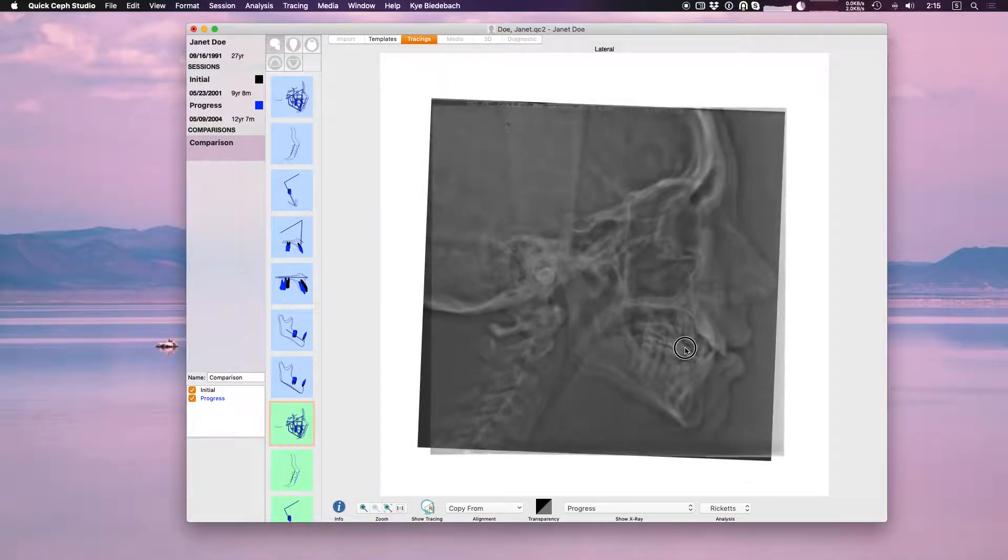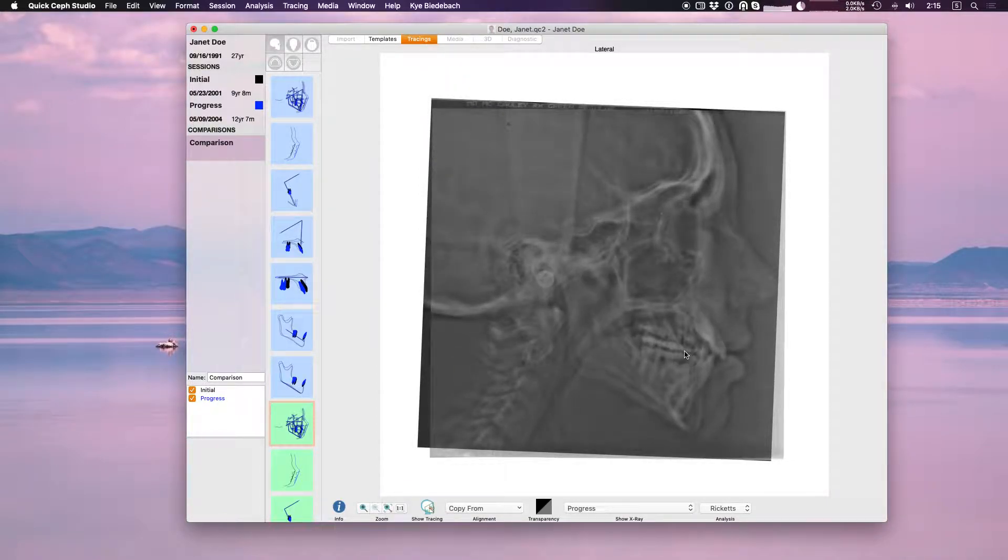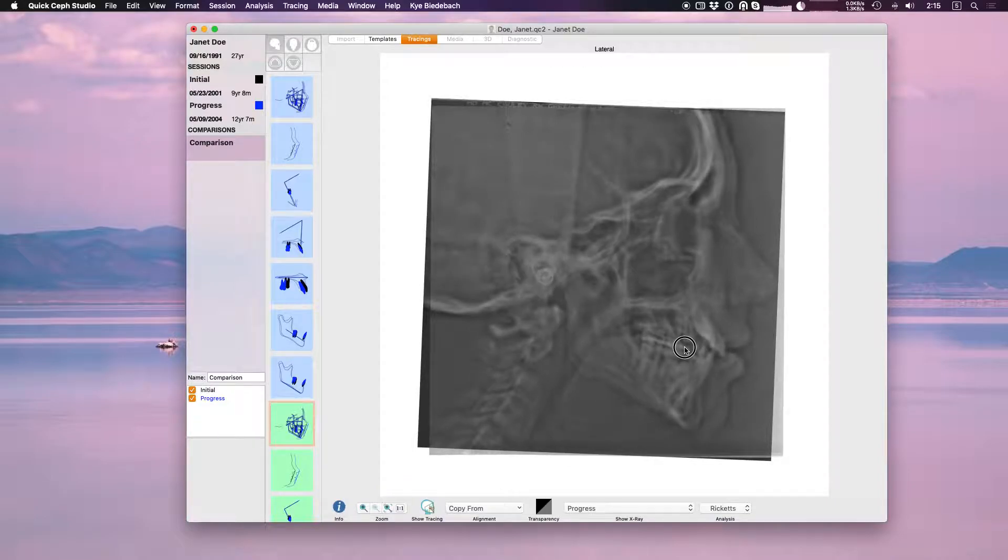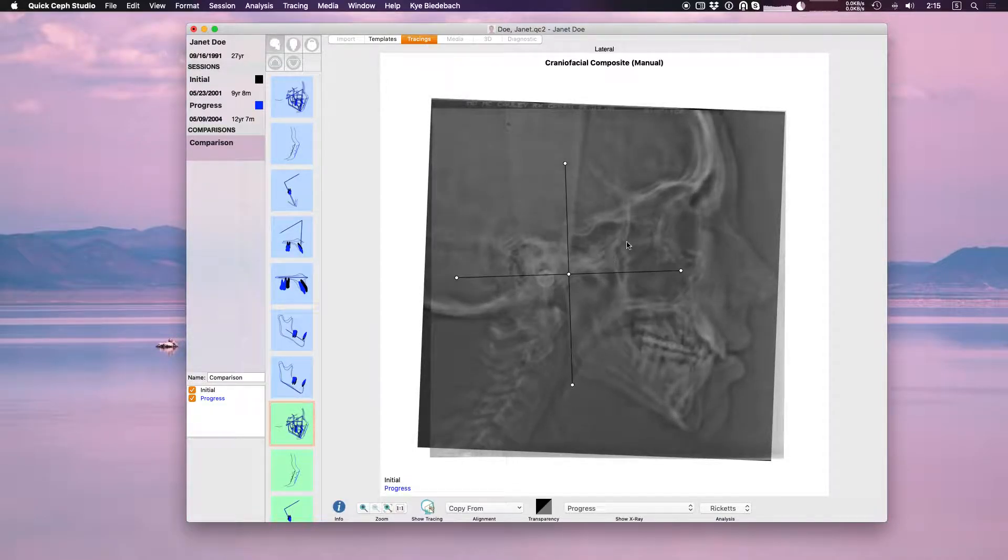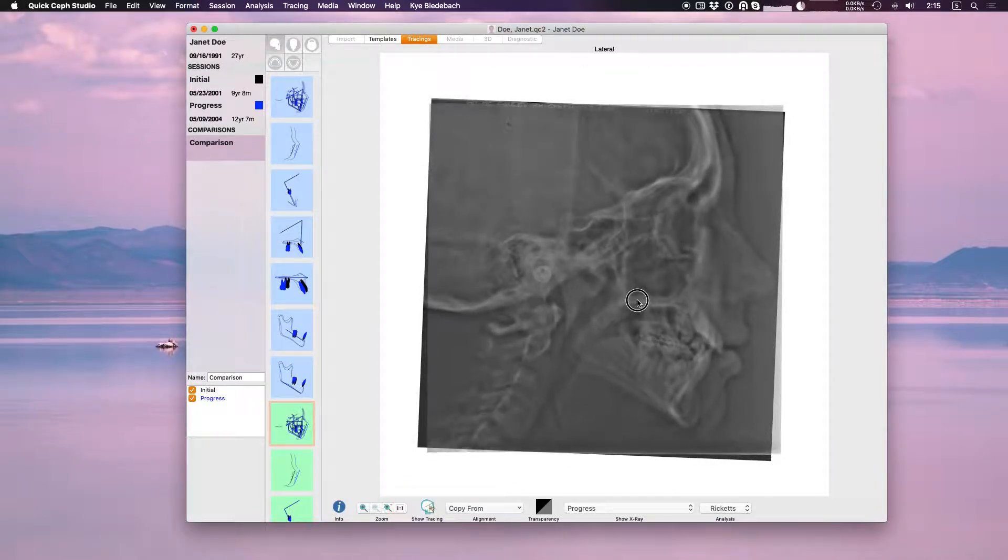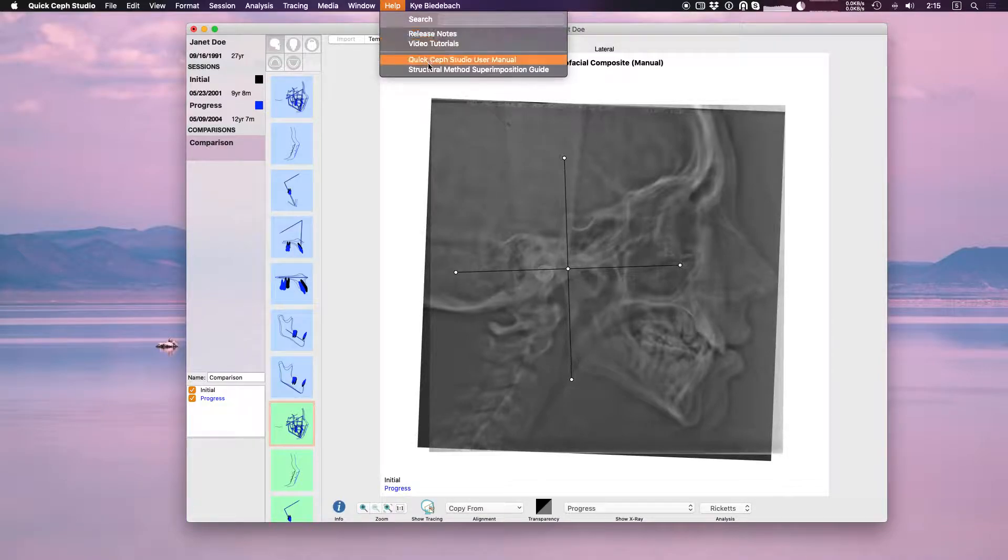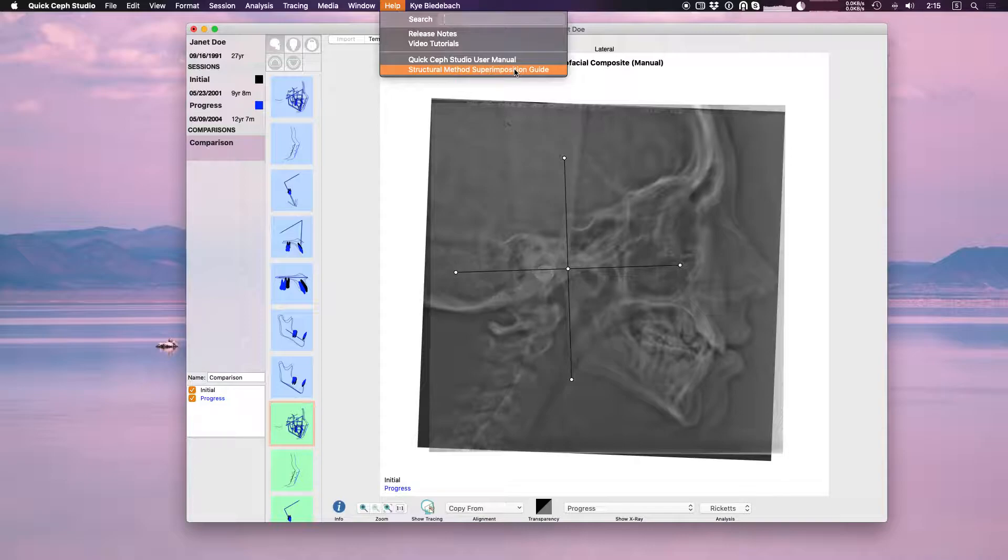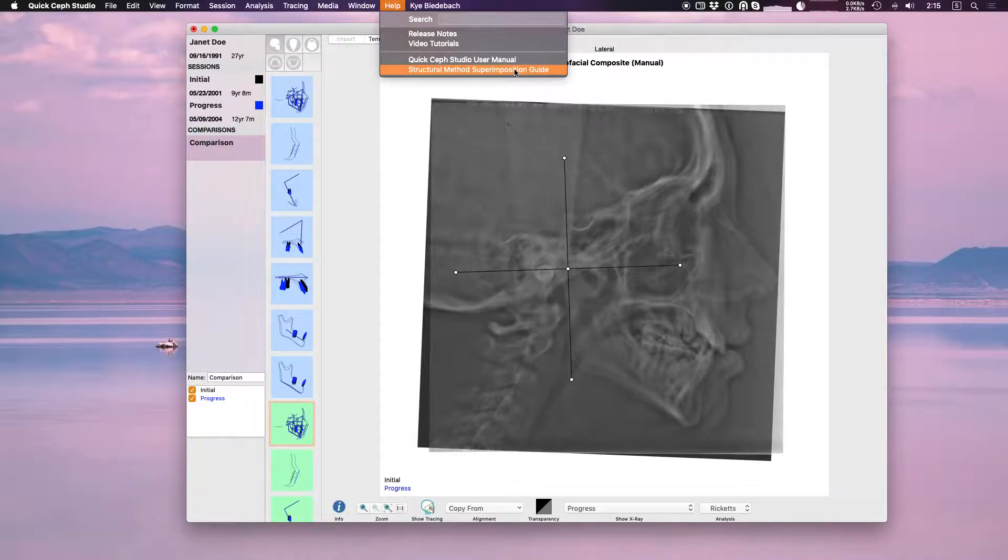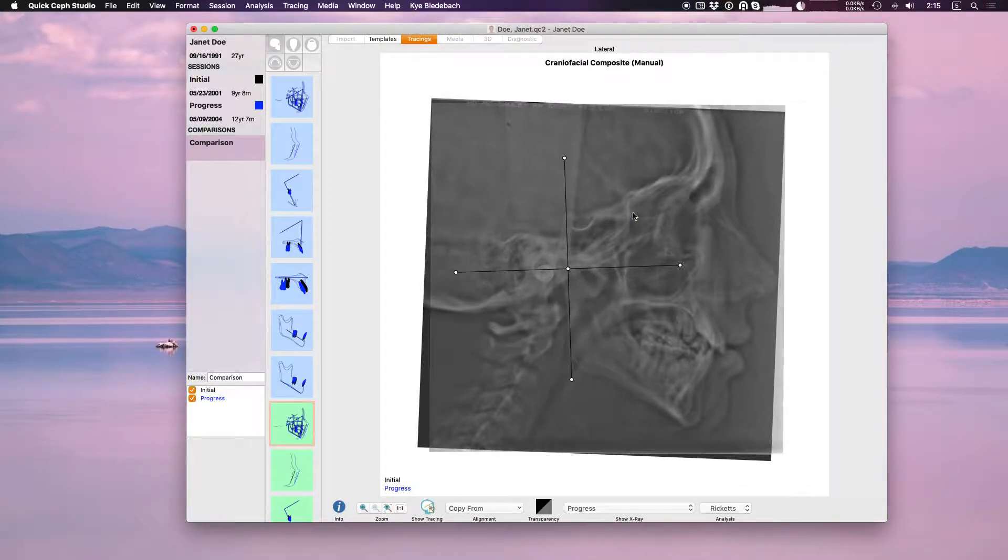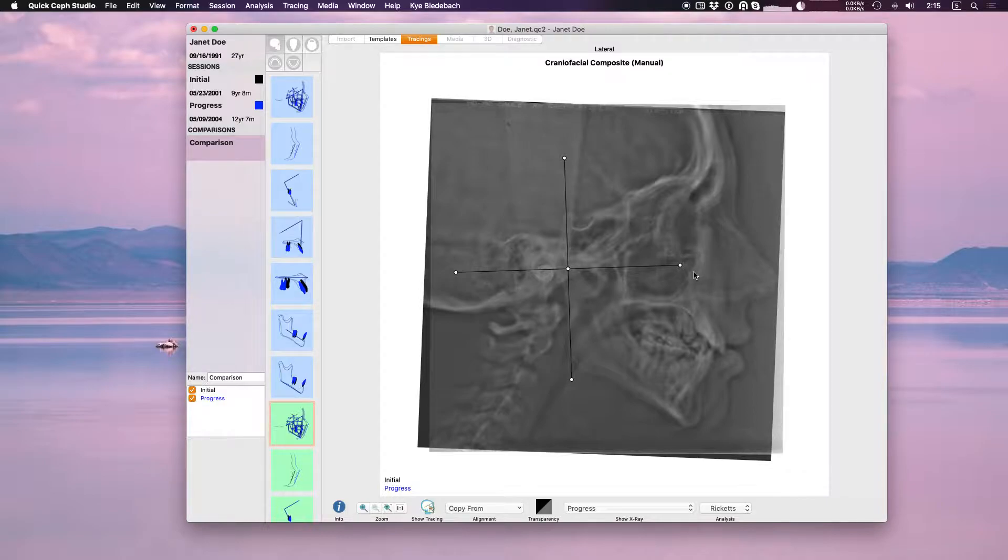In our opinion this is the most precise way to superimpose your x-rays because you're working on bony structure and not on a tracing which the tracing may have some inaccuracies. If you need help or if you've never done this bony method superimposition, under our help menu we have the structural method superimposition guide. This guide will give you the background details on what you're doing with this. In this guide they explain how to do it using Adobe Illustrator, but obviously you don't need to use that. You can use QuickSaf Studio and our superimposition features to do it much more simply.